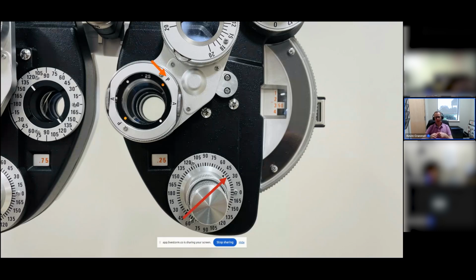And if they get the red dots, then you're going to subtract plus cylinder power. So a little confusing, very confusing, I know. The best way to do it is to try it out and practice, especially practicing with someone who is a good refractionist and can use the Jackson cross.